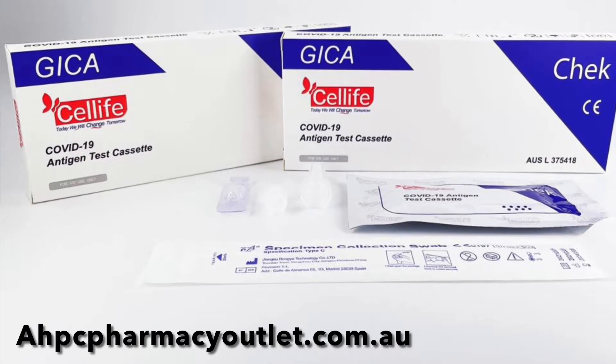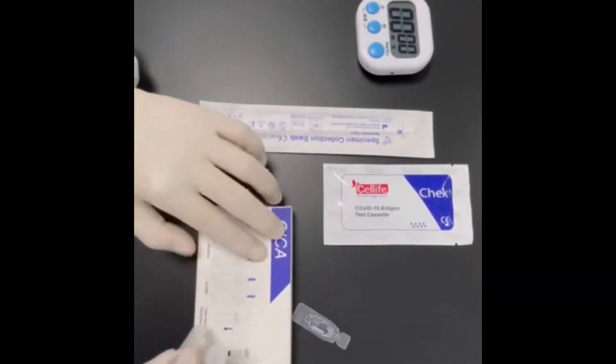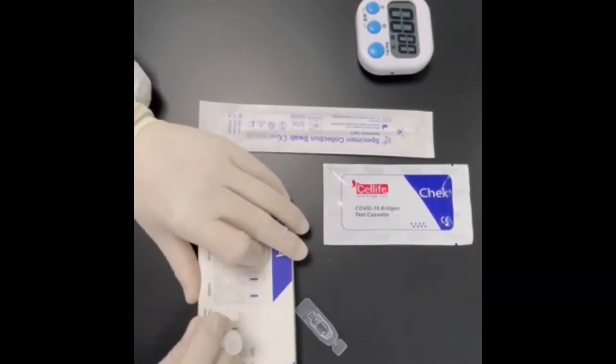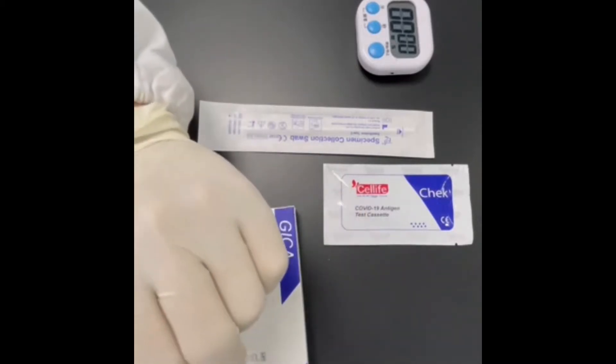CellLife Australia introduced our new COVID-19 antigen test cassette. Our easy to use kit contains a sterilised swab, a test cassette, buffer and the extraction tube.